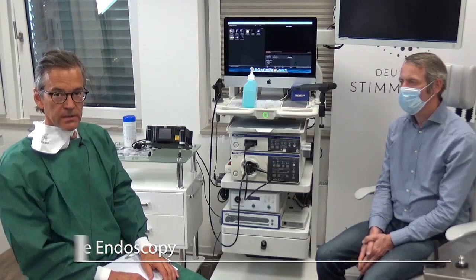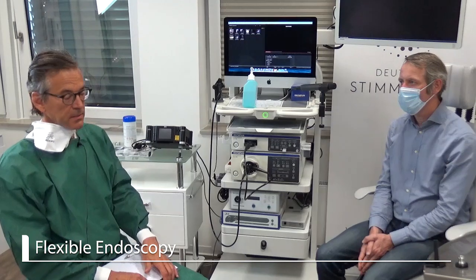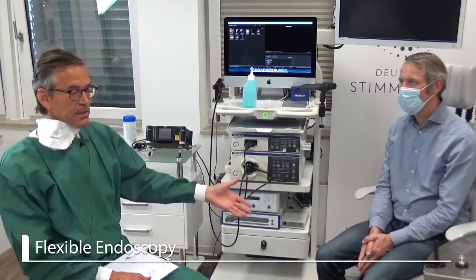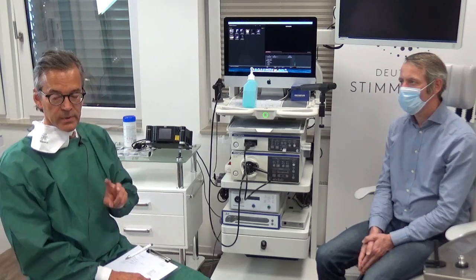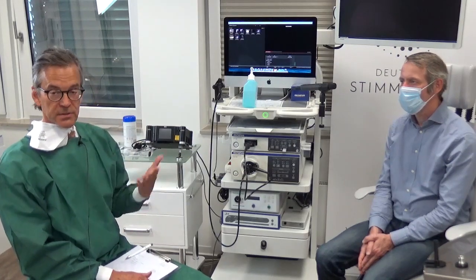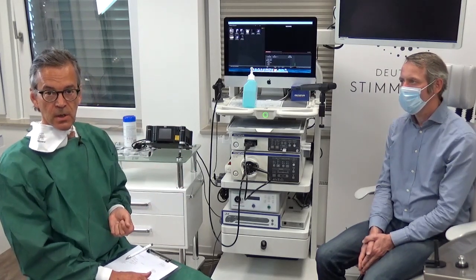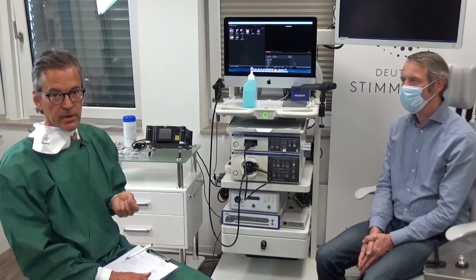After taking the history, we move to the endoscopy. For the endoscopy, the patient is already sitting in the examination chair. We — and there are always two persons — have to change our dressing according to what we want to do. We will now show you how we perform the normal transnasal flexible laryngoscopy.